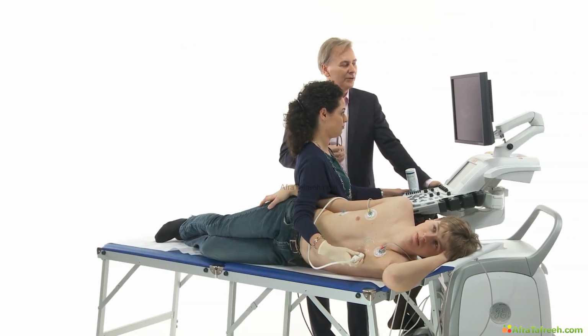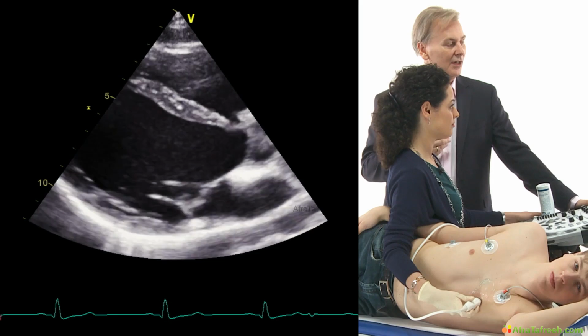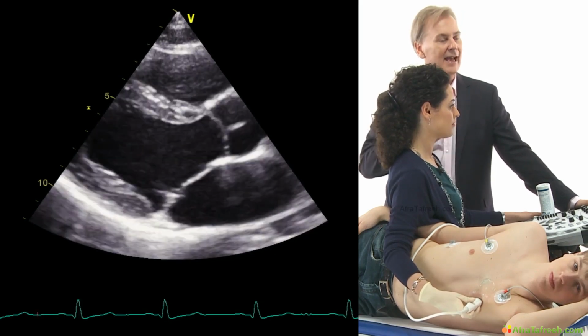I think this is so important to understand because it's a cut plane technique, and to understand we have to get a spatial representation in our head, and to do that we have to scan through the entire valve, and sometimes you will see pathologies only in one cut plane or very at the edge of, let's say, the mitral valve. So to do that you have to image the valve like Anna is doing it by scanning back and forth. And to give you a better understanding of how the anatomy corresponds to the cut planes, we're going to show you some images now.